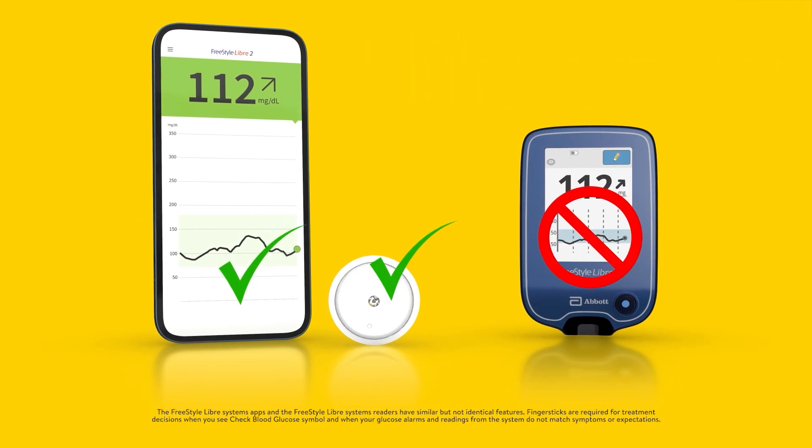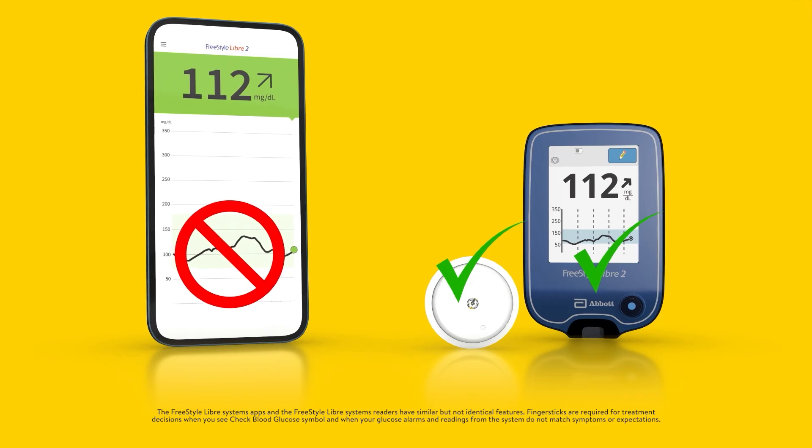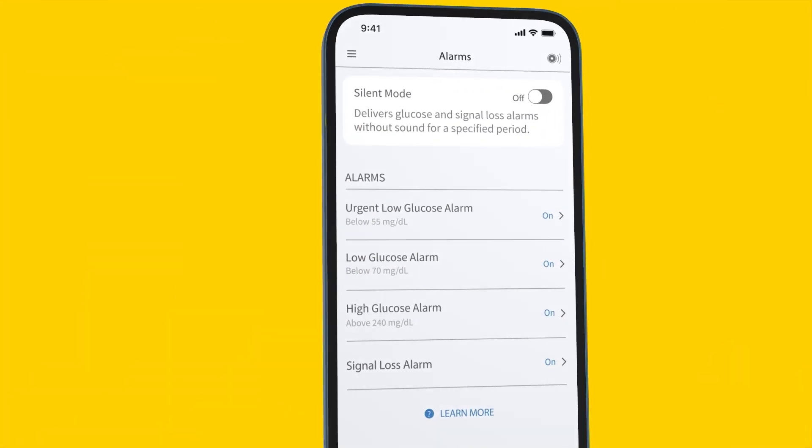It is important to note that the Freestyle Libre 2 app and the Freestyle Libre 2 reader cannot be used with the same sensor. Setting up alarms in the Freestyle Libre 2 app is easy. After opening the app on your phone, tap alarms in the menu. There are four glucose alarms.